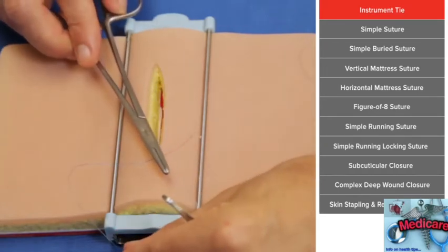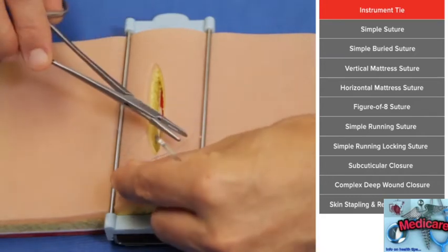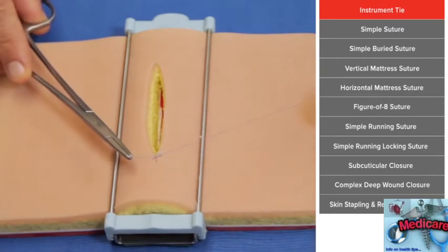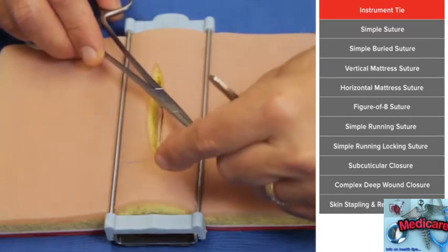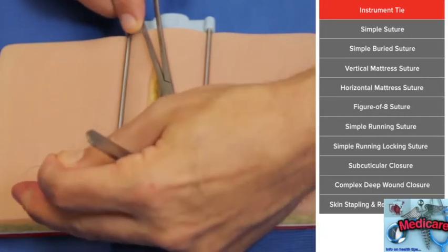For the next throw, I'm going to wrap the needle driver again, and this time just wrap it once. I'm going to grab the short end and pull it across, but don't pull up on it. You just want to tie it down till it gets down to the knot and then lock it down. Okay? Then simply put your needle driver between the two again, wrap it with the long side, grab the short side and pull it across.